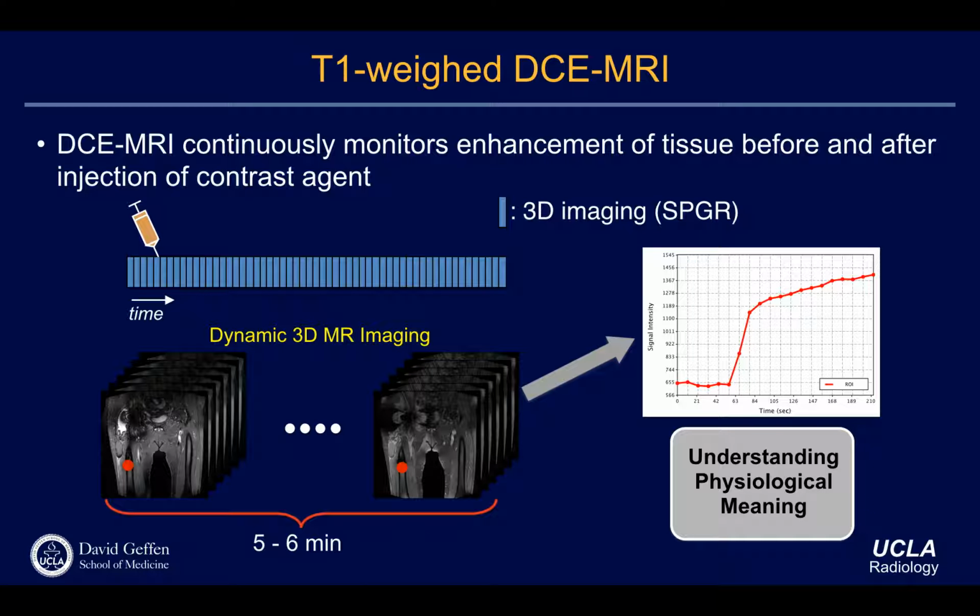Right. What that means is this one is a little bit darker, but by the time you inject the contrast agent, it goes up. The signal intensity goes up, right? At different locations, it may go really high and then down, or some different location may have a very slow up-slope curve. So again, depending on the location, you will have very different responses.